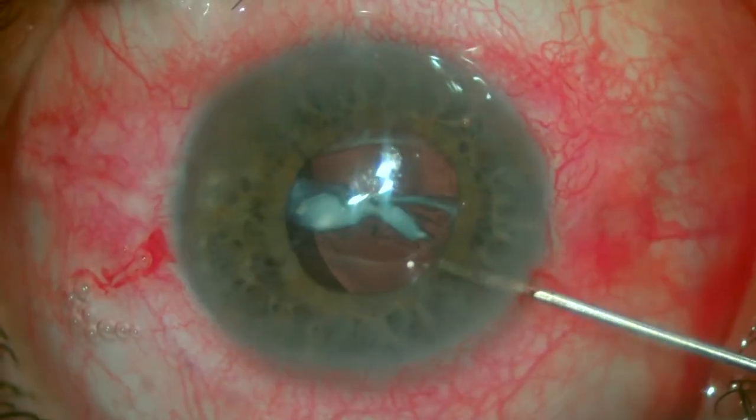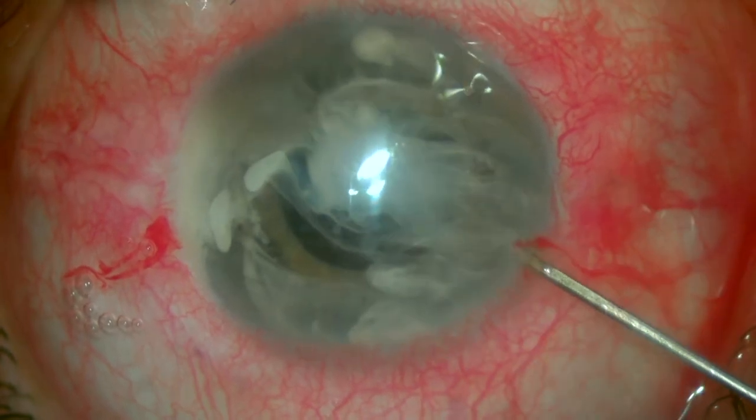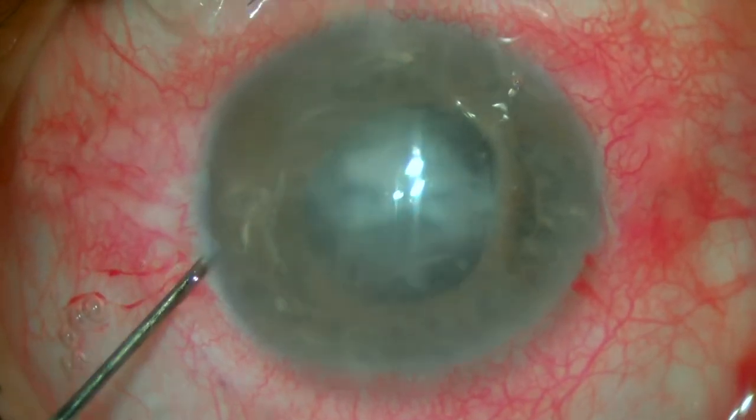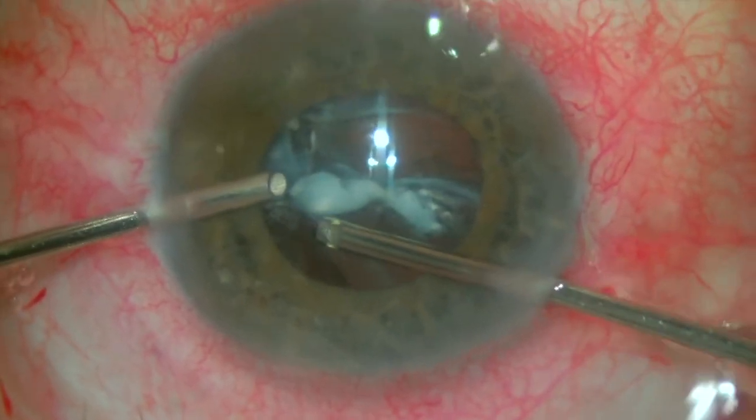We begin this case by making two paracenteses through which the vitrector probe and the irrigation line will be inserted in the eye. We like to use some triamcinolone in such cases to better visualize the presence of any vitreous strands in the AC and guide us in the anterior vitrectomy.